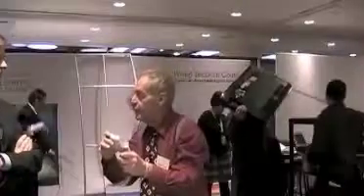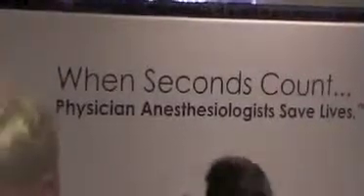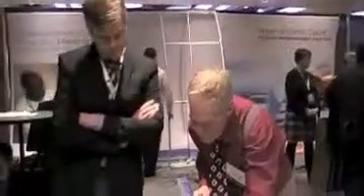The best design for me was the Mac Blade, video empowered with a camera in the distal region and a screen on the handle. That's my best mode. My patent covers, the key of the patent is camera means mounted on the blade in the vicinity of the distal end. That is why I got the patent, because the distal end is the key.